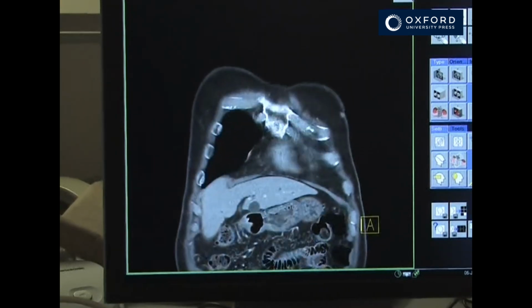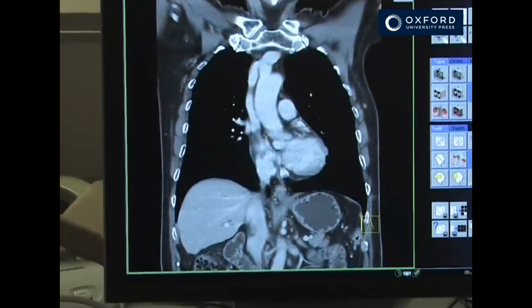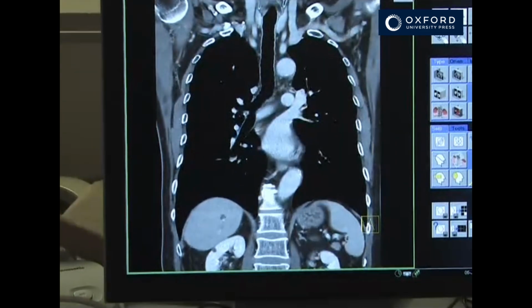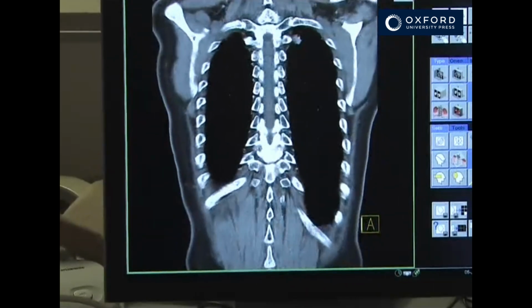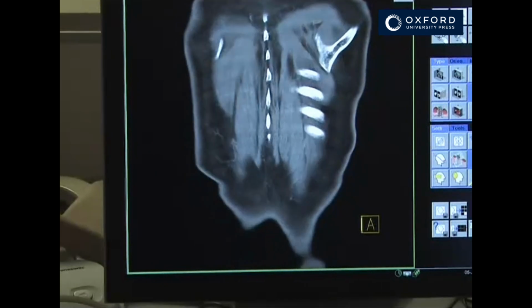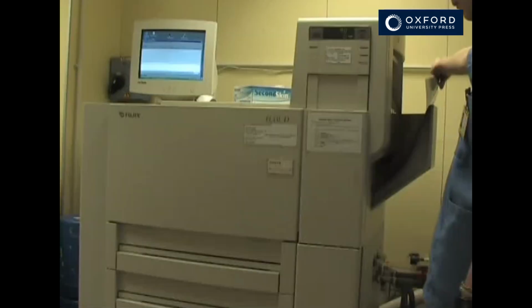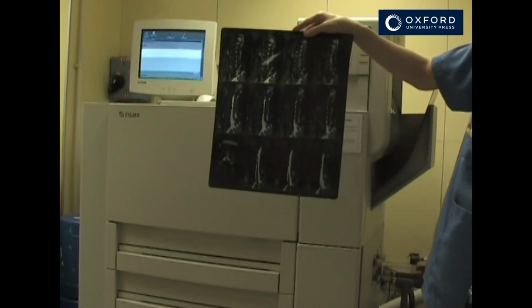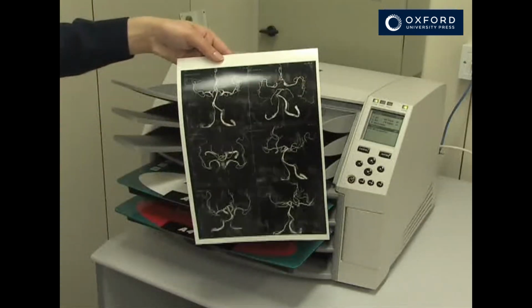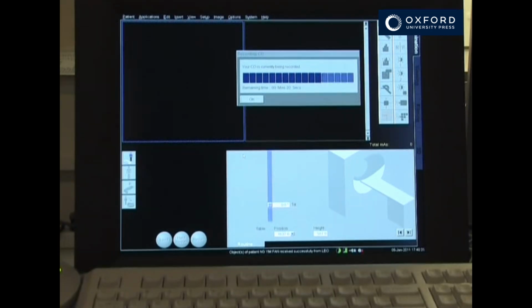After the process has been finished, the computer will construct images from the data, which is effectively an attenuation map. It can also generate three-dimensional images. The images obtained need to be processed by the radiographer. The processed images are then output as films, color prints, or CD-ROMs.